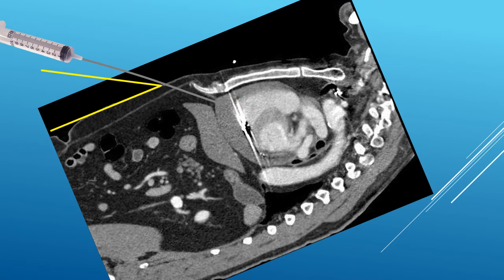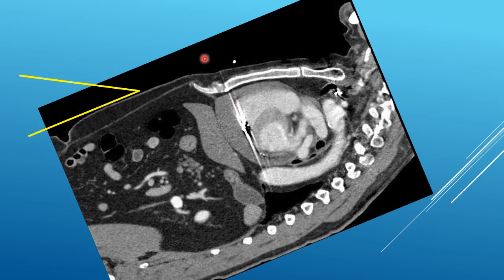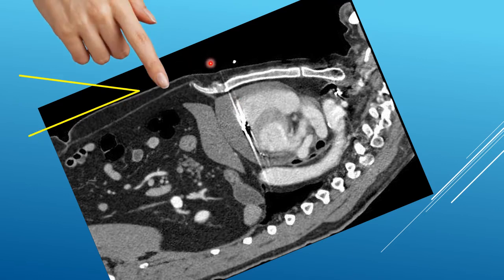If it's important to achieve our 30-degree angle, often by pressing down around where we're inserting the needle, we can get a centimetre or so down from the surface to help us with this 30-degree angle. But that's not always possible.